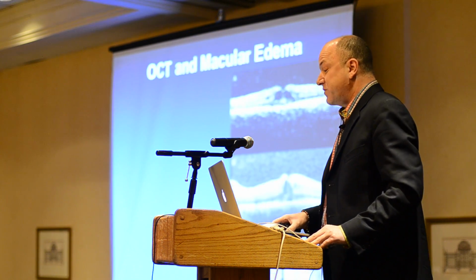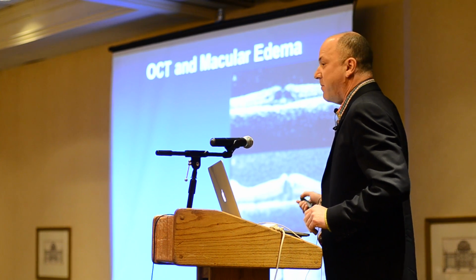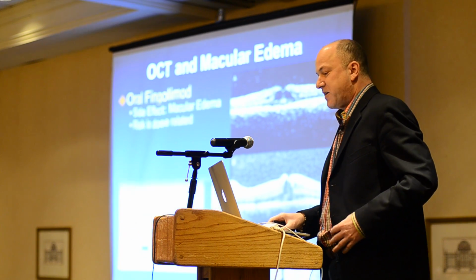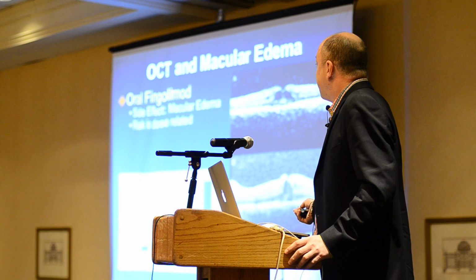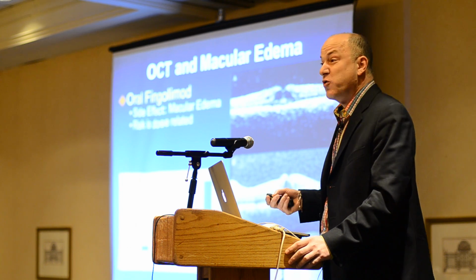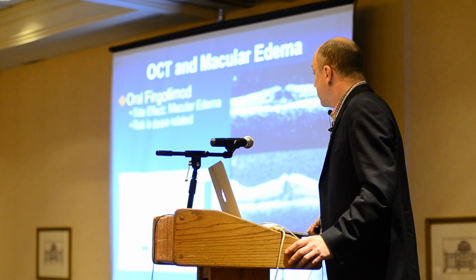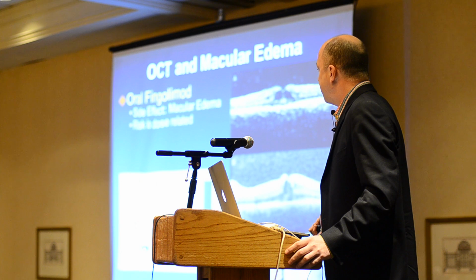Why else do we use OCT? We use OCT to find swelling in the retina, what we call macular edema. And macular edema is associated with one of our MS therapies, oral fingolimod or Gilenya. In fact, that side effect of macular swelling, which generally goes away when you stop the drug, is less common as you go to our current dosage of the drug, 0.5 milligrams.